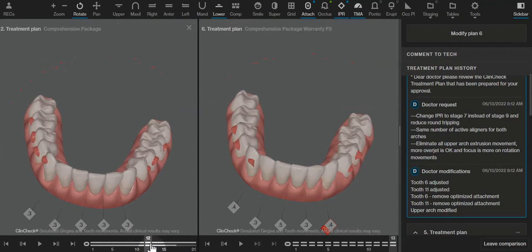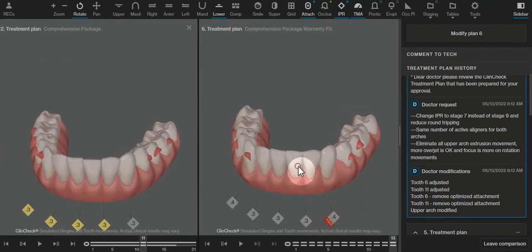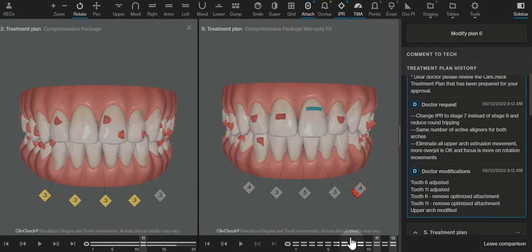We really do not need to wait until after aligner 10 to do IPR for this case. That significantly reduces the number of aligners and also helps protect the buccal bone from having these teeth come too far forward and then come back.